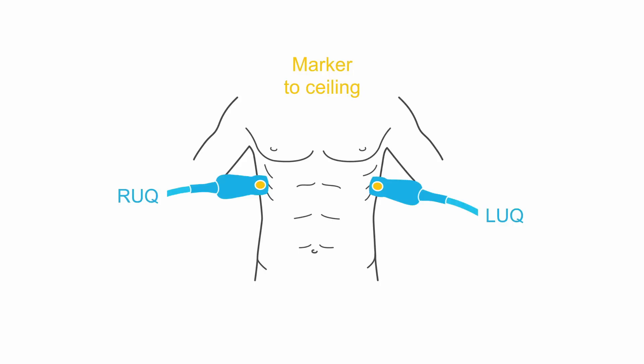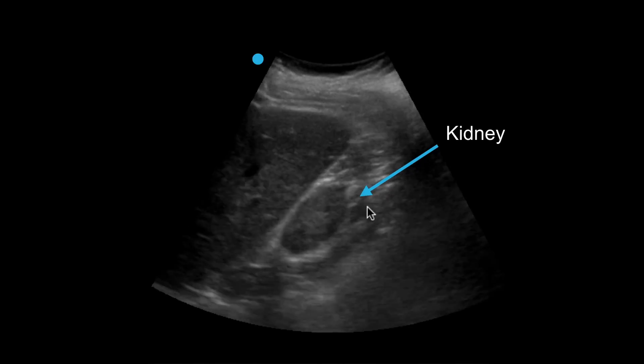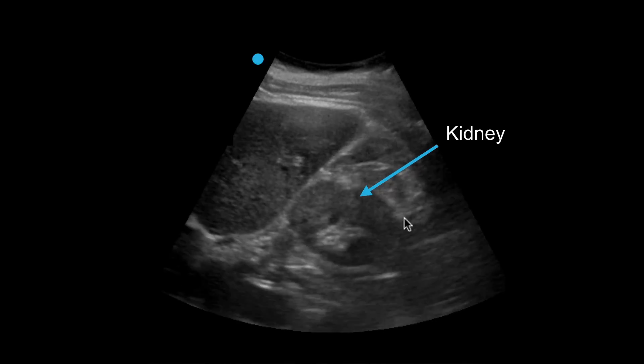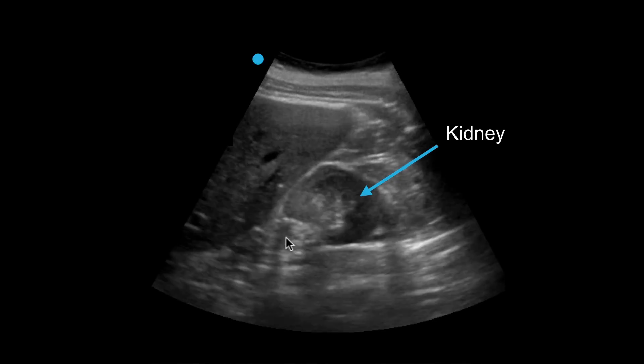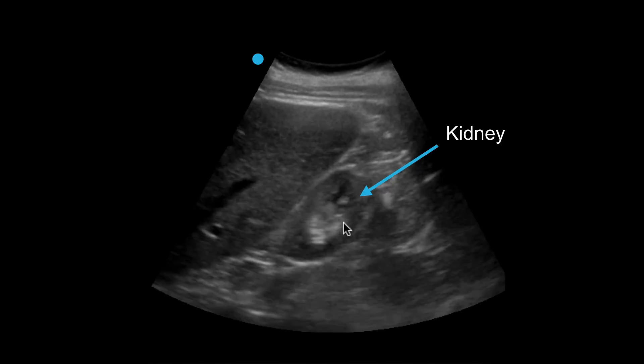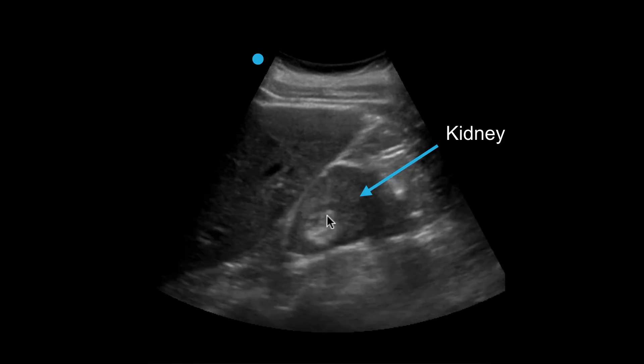To obtain your image in short axis, you're going to rotate your probe 90 degrees to now have your indicator pointing towards the ceiling. This is what your kidney will look like in short axis. Notice it'll have a more circular shape and your renal pelvis will be identified by the bright white hyperechoic region in the center.